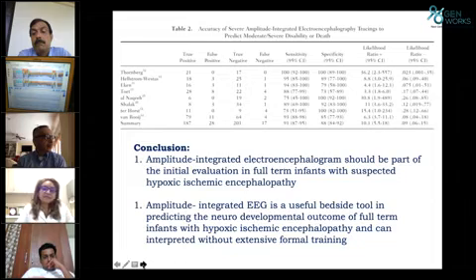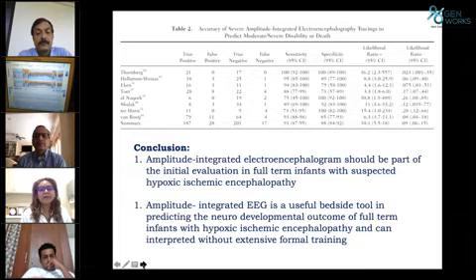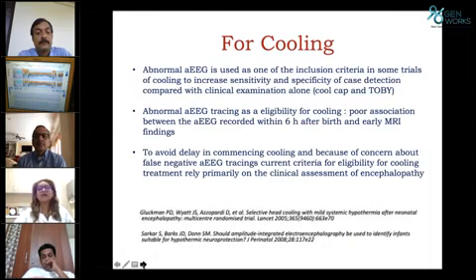And as a sixth thing, I would say that if you have this kind of baby, aEEG should be equally important as a bedside tool to predict the neurodevelopmental outcome of a full-term infant with HIE. And you need only a little bit of training, not a very big formal training, for seeing this.